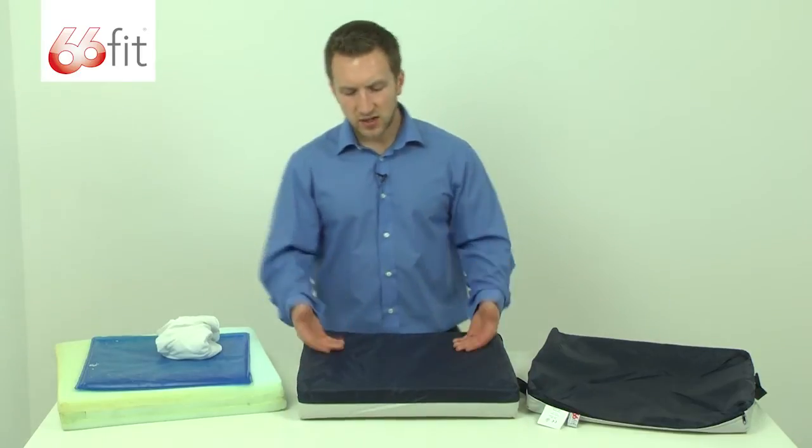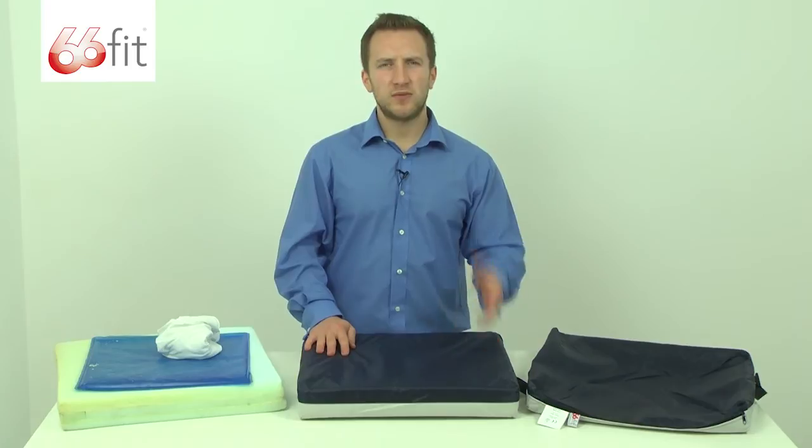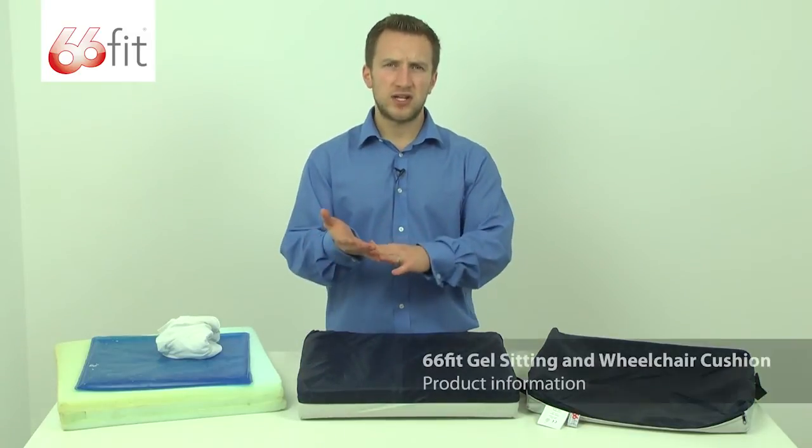Along with that, it's also designed to raise you up when you're sitting in a chair. So if you're sitting in an armchair at home and you're sitting a little bit too low and you're struggling to get in and out of the chair, stick the cushion on there and it's going to help you because it's going to raise you up that little bit.